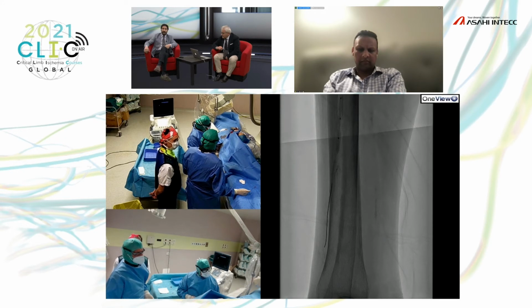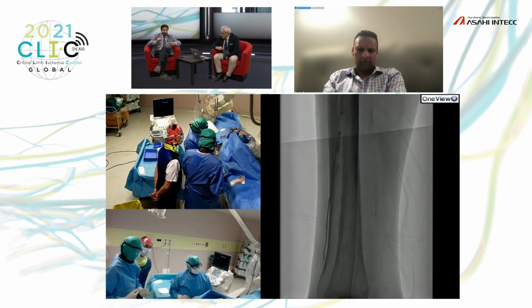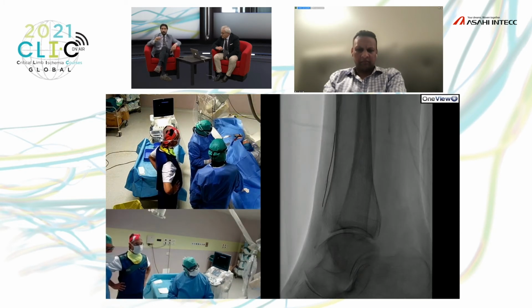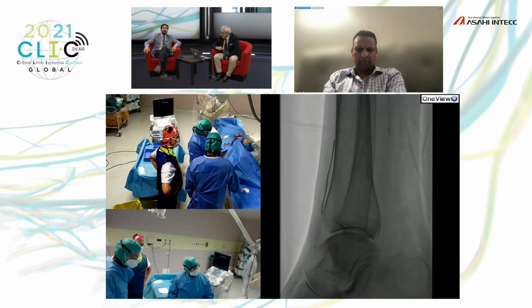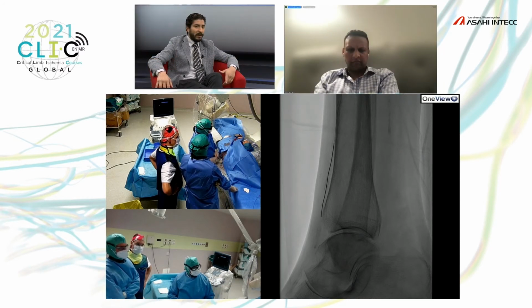I remember when I tested it, it happened in Abano and also now in Cotignola. I remember I also changed the technique. I never drill 360, but what I did was to go up and down, so right and left, half and half of the movement, replicating what you are showing there. Yeah. So again, it's a new guide wire that needs a different technique.